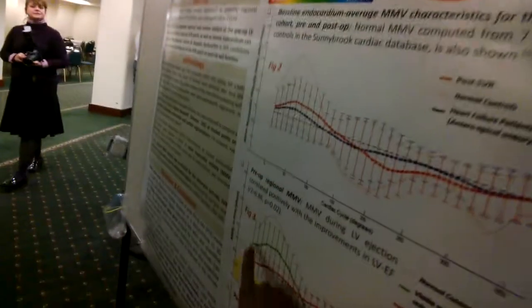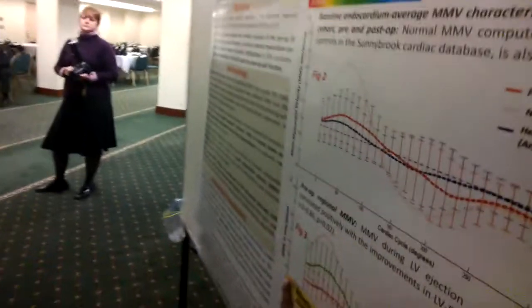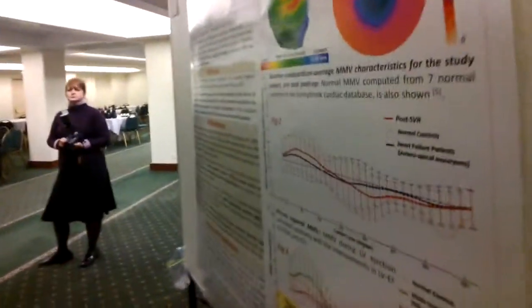So now if I took just that aneurysm region and just the base region separately, you'd find that the basal region had a mean myocardial velocity characteristic and the aneurysm had a different one. They are out of phase, so that indicates the dyskinesia. It kind of validates the paradigm of using this technique.